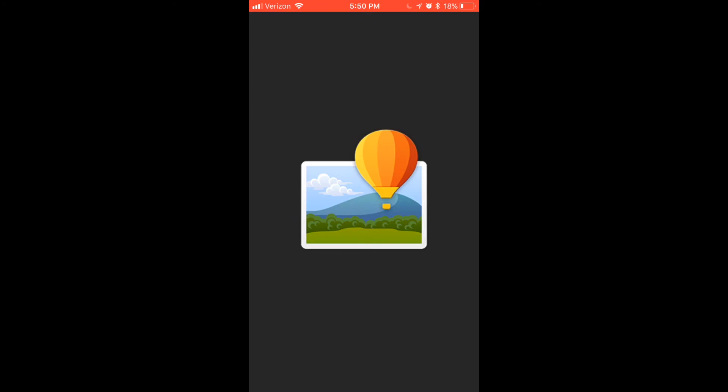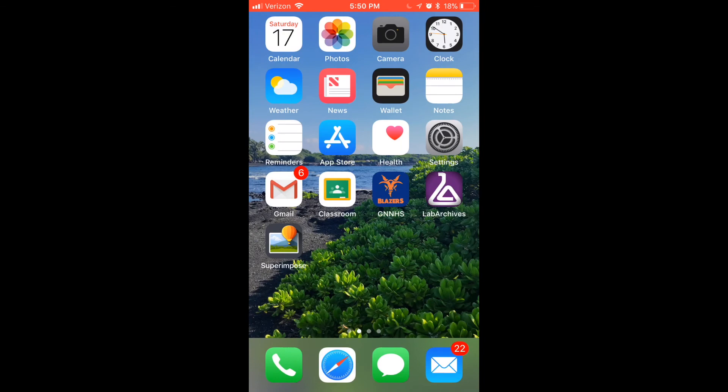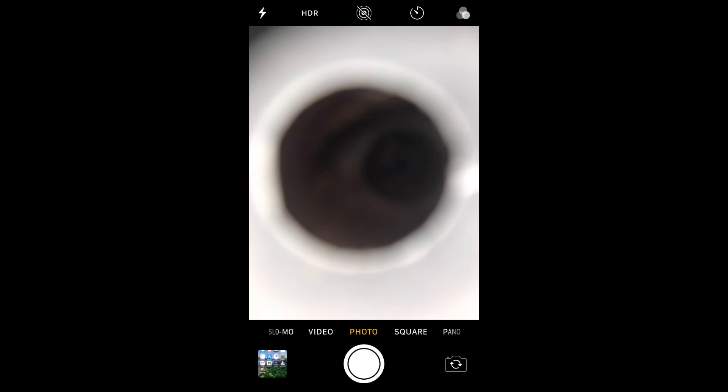So before we can even superimpose anything, we have to take a picture of the cornea. So to do that, I'm going to go to my camera, and I'm going to be capturing an image of my dad's eye right now. So I get very close to his cornea, and focus my camera so the rings are focused nicely. And I capture an image, which you can see here.